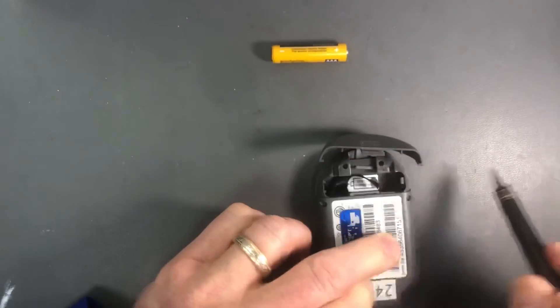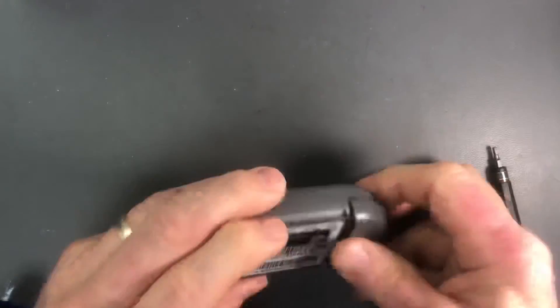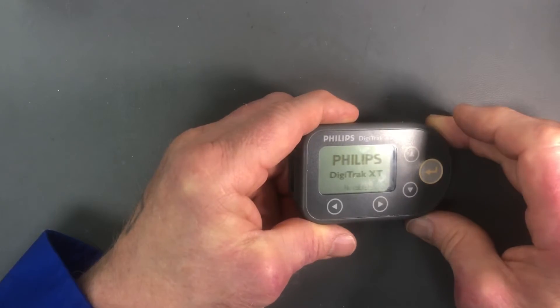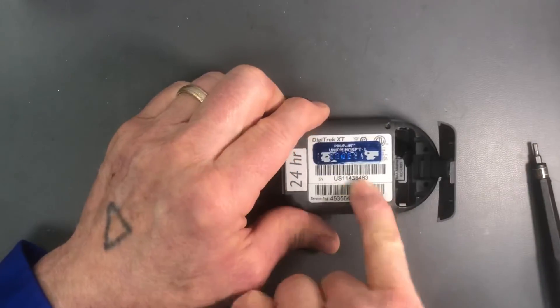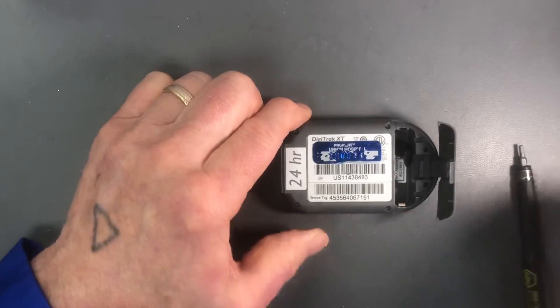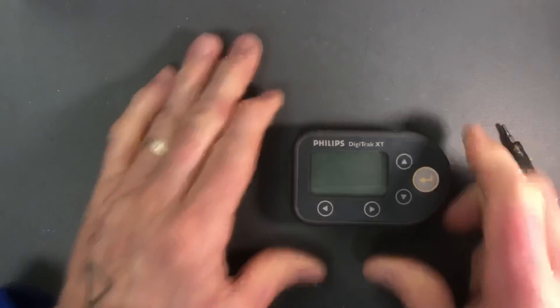There are no seals for the battery compartment screws. Do a final check — Philips Digitrack XT, everything looks good. This repair is complete. Make sure that you document your serial number so that you know that unit has been remediated. That's it for this video.